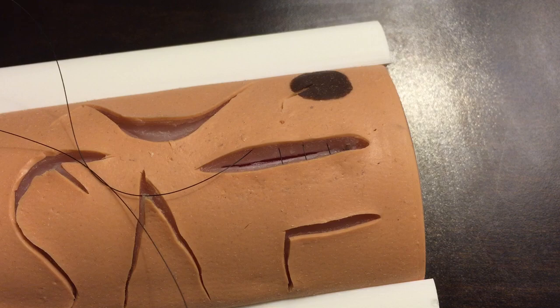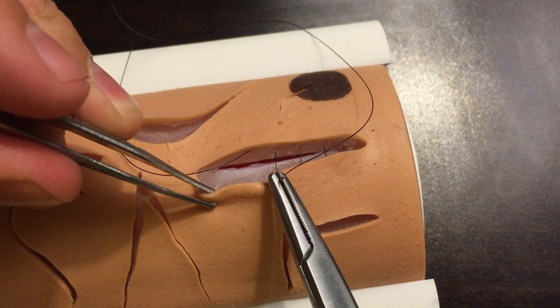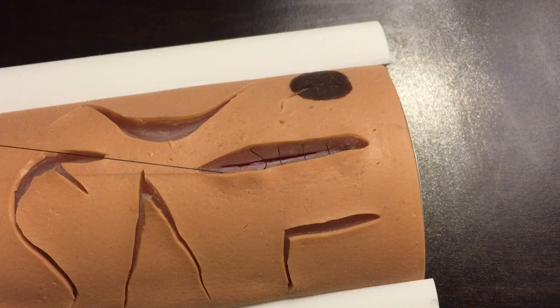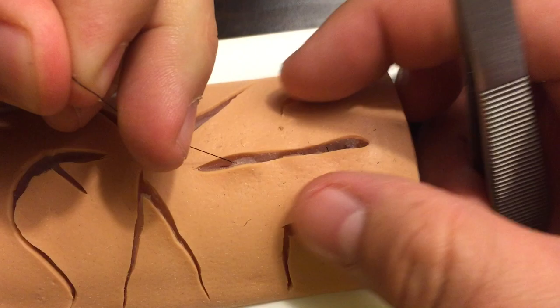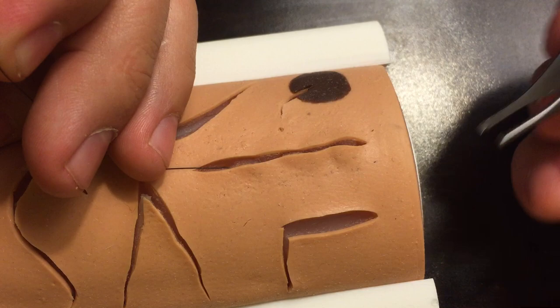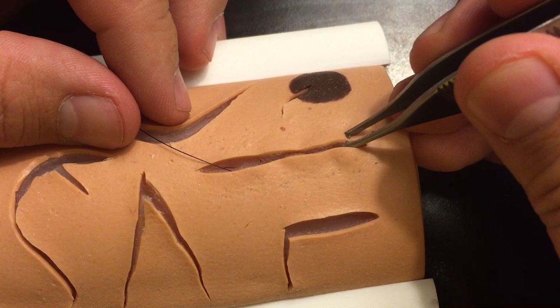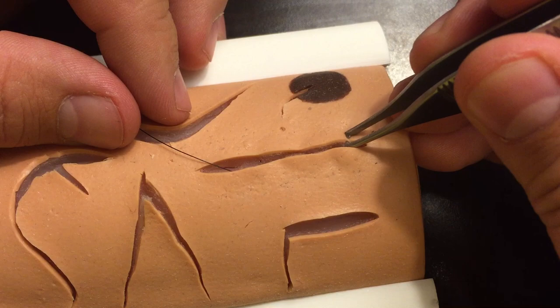I'm going to leave myself some room at the end so you can see what I'm doing when we close it. Coming right there, staying superficial. Let me pull on this a little bit to show you how it starts to close — giving it a little snug, sometimes reaching up with my hands to pull it together so it approximates appropriately. See how it's pulling the skin together — the skin edges are being a little bit everted. It's opened up down here because my first throw pulled through the tissue — I've used this model so many times for videos.